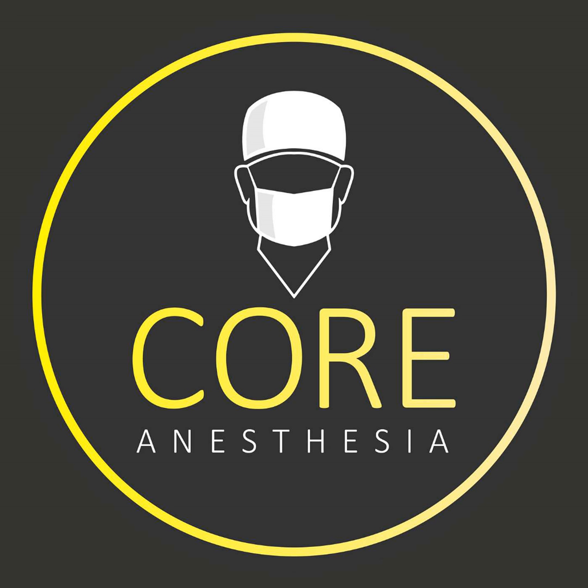The difficult airway algorithm, one of the main problems that we have is that we try the same thing over and over. We don't move on to the next thing. And so I would just tell you to take your time, make sure that you really are going through every step. Oftentimes it's as simple as, if you're using a Mac blade, not getting that situated far enough into the vallecula. And that's why you're not getting a good view. You're not getting the epiglottis to flip out of the way. And you think, okay, I've swept the tongue.